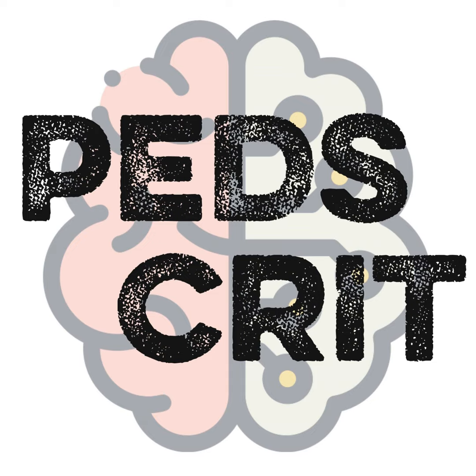Conversely, if you told me somebody had like abdominal sepsis, okay, just systemically blew up, like a lot of non-focal diffuse pulmonary edema from a non-pulmonary source, but as long as they're hemodynamically not too bad, then I actually try a different strategy. I do the exact opposite. I do what's called a decelerating PEEP strategy. I actually set the PEEP at something like 16 or 18 to start with. I recruit as much as possible. I tolerate PIPs, okay, less than like 50. And then I march down.